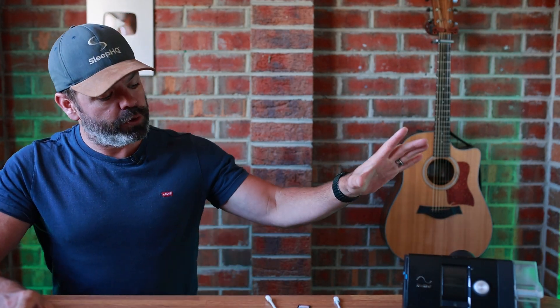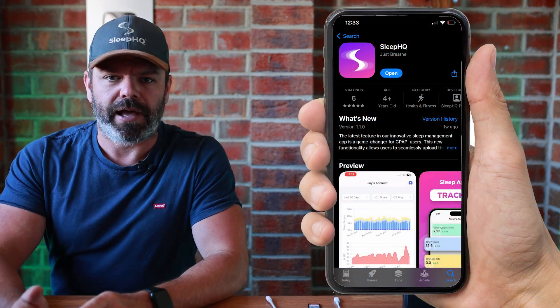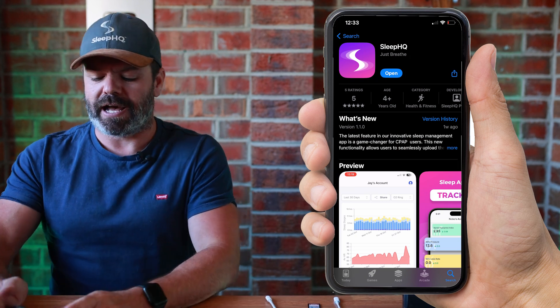G'day mates, welcome back to the channel. Today I'll show you how to upload your ResMed AirSense 10 SD card data directly to your iPhone using our brand new Sleep HQ iOS app, and we'll do it in under a minute.